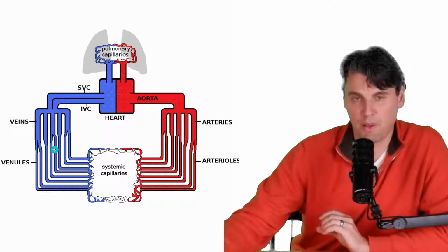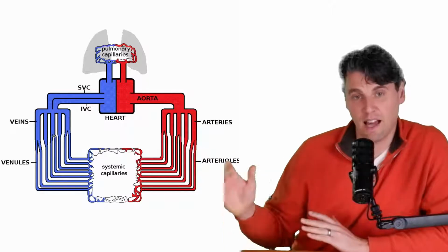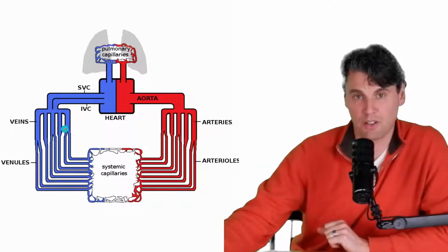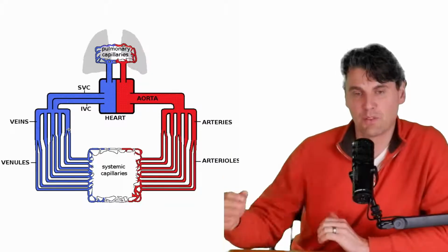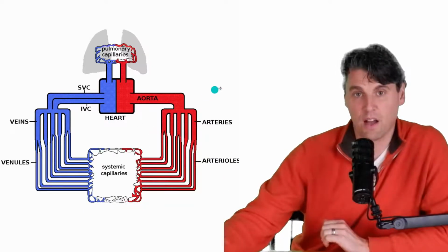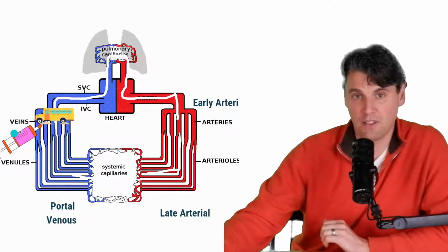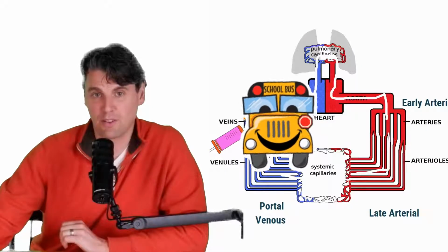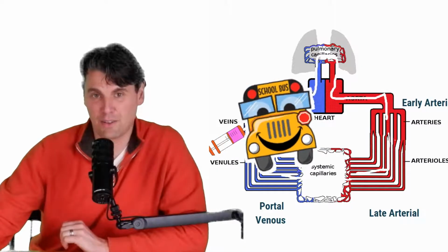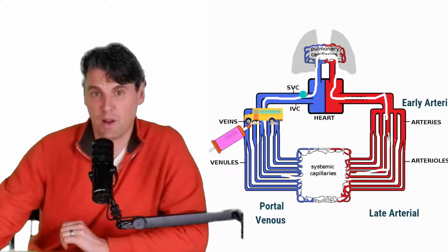For the purpose of what we're doing in CT, we're actually going to inject contrast into the veins. It's a lot easier than doing an intra-arterial injection from the perspective of establishing the IV, also from the perspective of the risk of infection for the patient. So we have our IV injection shown right here. Then we have our little yellow school bus shown here. That's going to trace us through the path that we're going to go through. We're following this white line here.